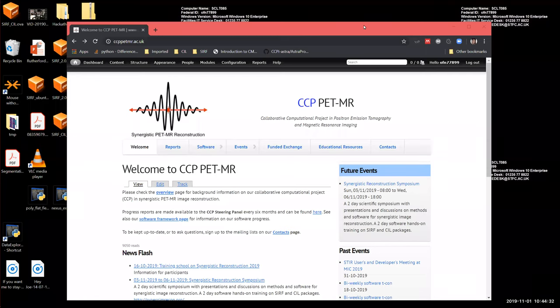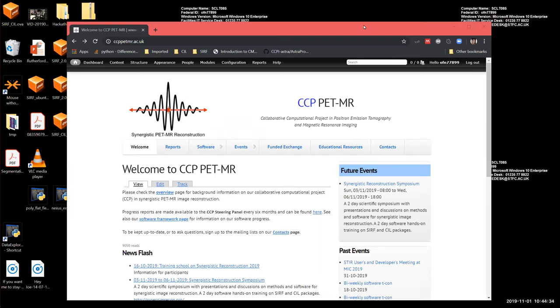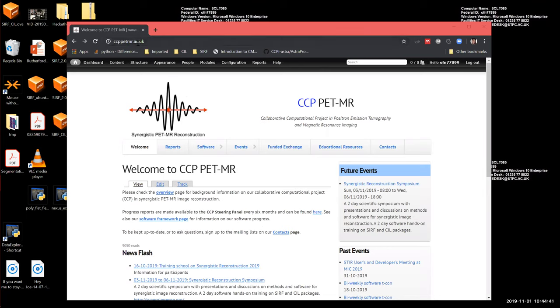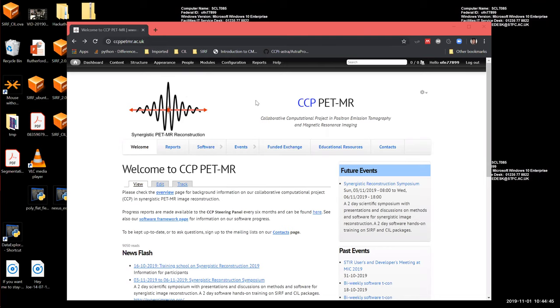Okay, I would like to show how to install and run the virtual machine for the Training School on Synergistic Image Reconstruction. So first of all, you go to the ccppetmr.ac.uk website. And then you find this link, Training School on Synergistic Reconstruction 2019.